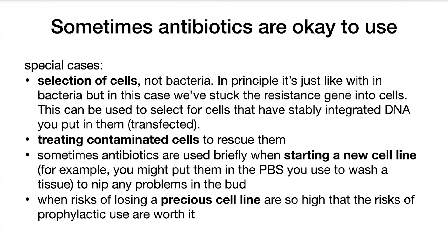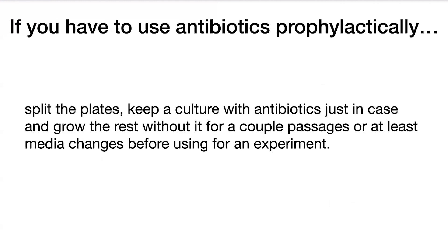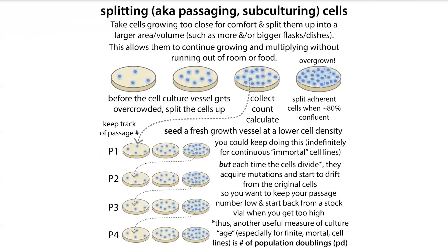Sometimes you do use antibiotics prophylactically when the risks of losing a precious cell line are so high that the risks of prophylactic use are worth it. If you do have to use antibiotics prophylactically, what's best is to split the plate — take the cells that are overgrowing and split them onto multiple plates, diluting them. We call that splitting or passaging.